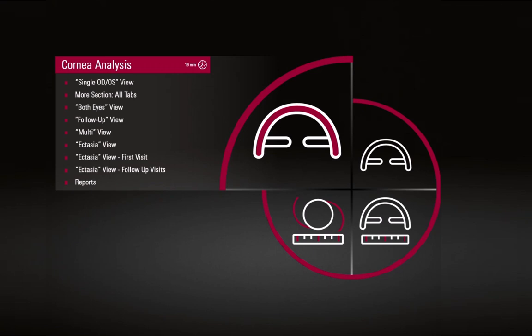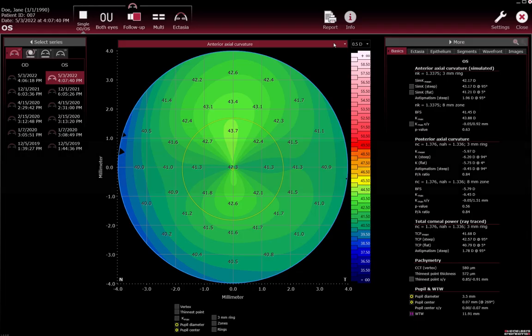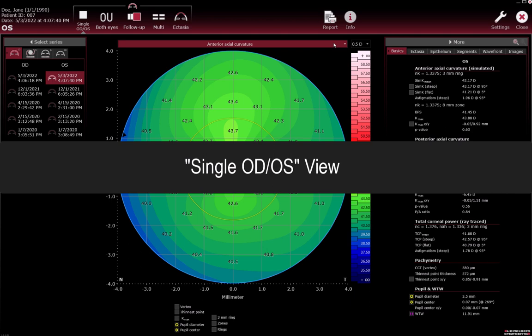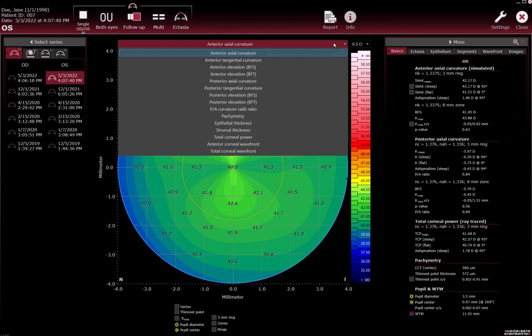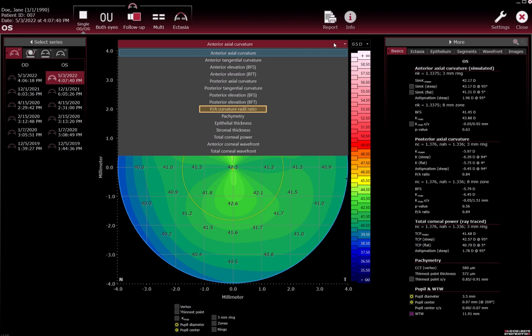Cornea Analysis. In the Single OD/OS view, select and review a colour map in the drop-down list. Available maps include Anterior Curvature and Elevation maps, Posterior Curvature and Elevation maps, PA Ratio Map, Pachymetry, and Total Corneal Power.